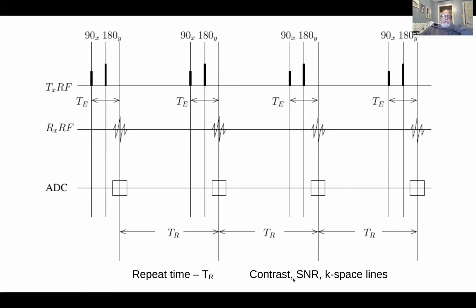That is a standard way of increasing your signal to noise ratio through averaging, because when you average signals, the signal will increase by a factor of 2, but the noise only increases by a factor of square root 2. So you end up with more signal to noise. And also, as we'll see, we're going to use different TR instances to get different lines in k-space.